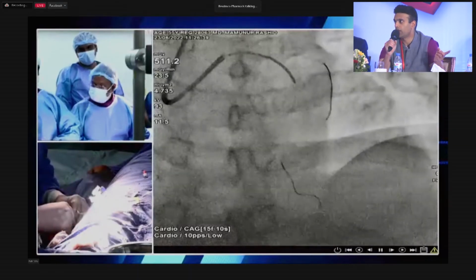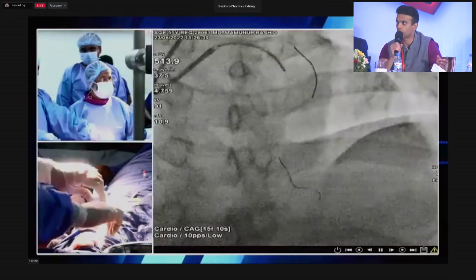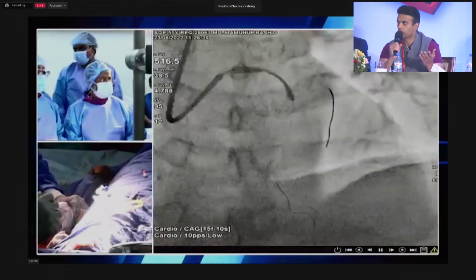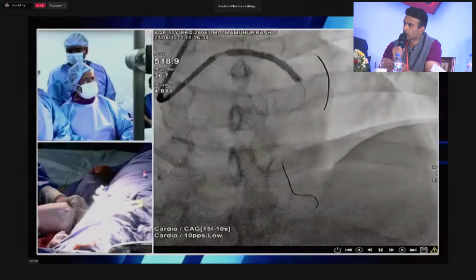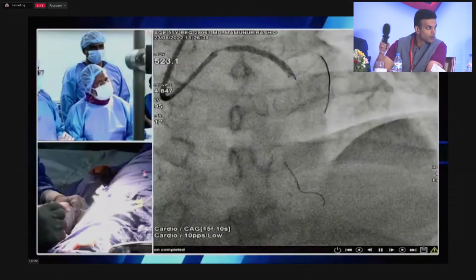If you're going to land into 40% plaque, then Dr. Gambhir's approach, I think, is an advised approach because you have a lower chance of dissecting at the level of the plaque. If you're deploying into normal vessel, which I think you have based on your IVUS, you're going to be fine with an under-deployed 4.0, which is then post-dilated to reflect an optimal size.